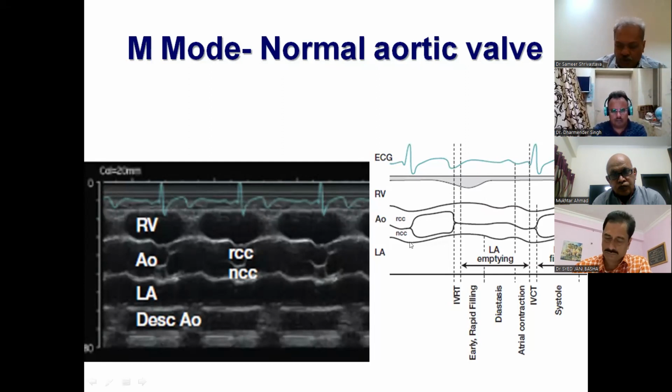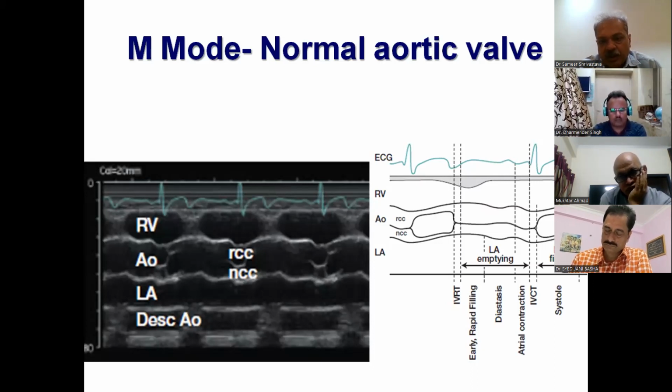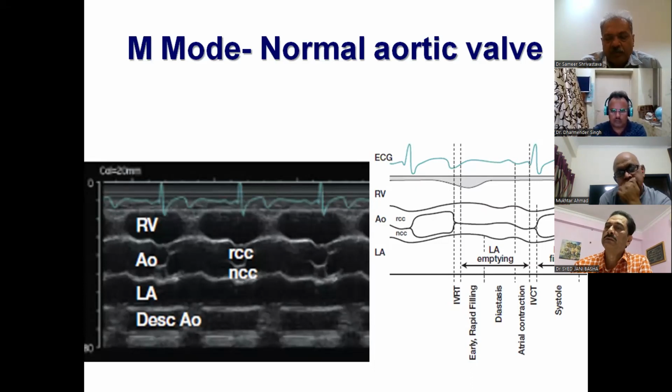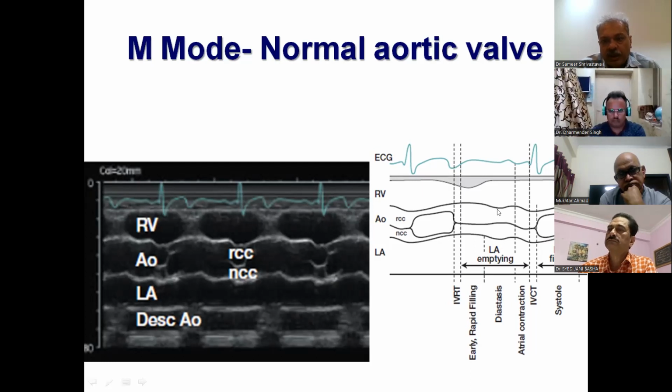However, these are issues where you have to be careful about what you are dealing with, because this is something very important, and at the end of the day, it is the shape of the box which matters so much. This shape of the box should be like a box, and this line of closure should be central. Now, this is a very important imaging method to find out whether it's a bicuspid aortic valve or not, because most of the times bicuspid aortic valve has an eccentric closure line. That means it is not right in the center. It is either superior or inferior, and if it is not central, hunt for a bicuspid aortic valve. This is the first indication that you might be dealing with bicuspid aortic valve.